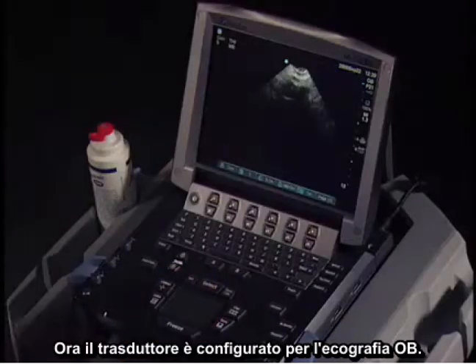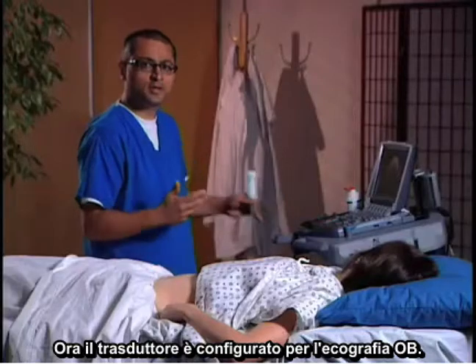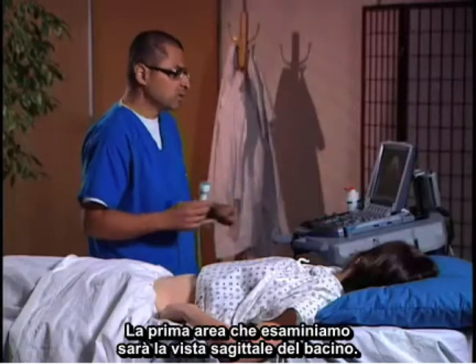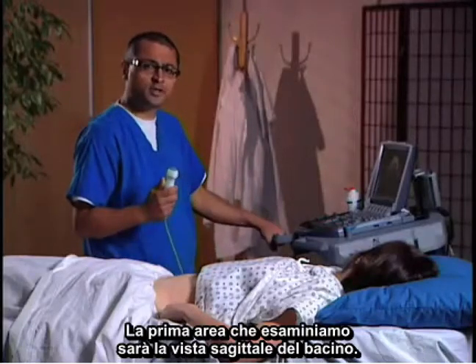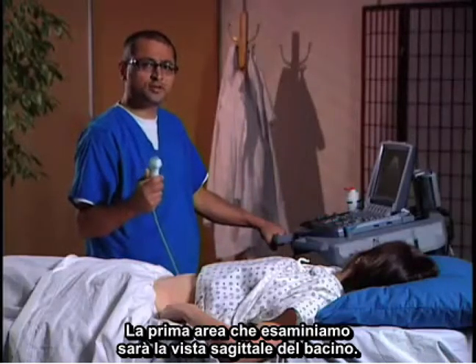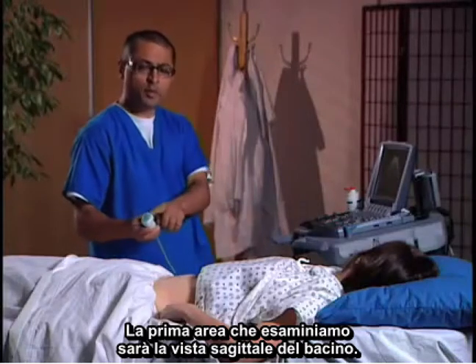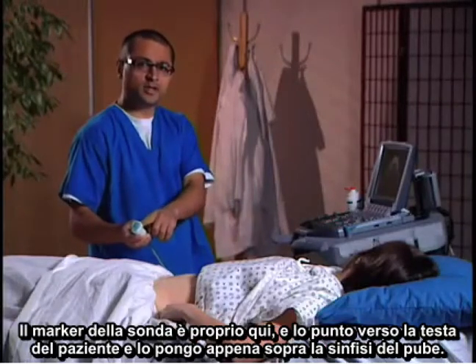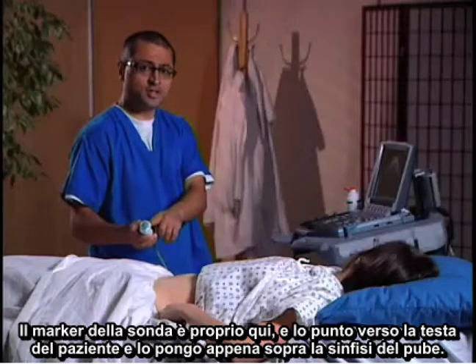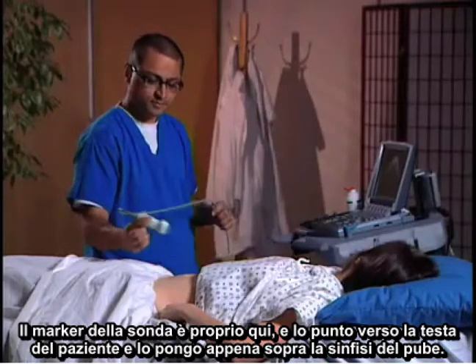The transducer is now configured for OB ultrasound. The first area I'm going to scan will be a sagittal view of the pelvis. The probe marker is right here, and I'm going to aim that toward the patient's head and place it just above the symphysis pubis.